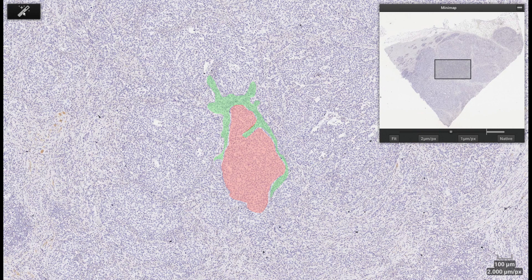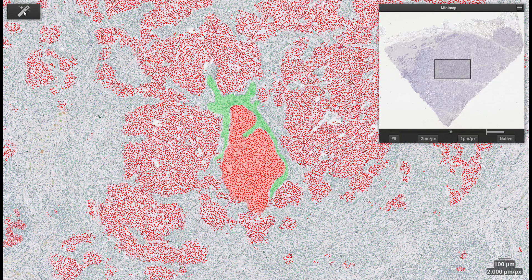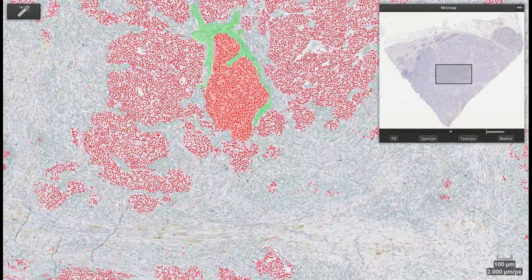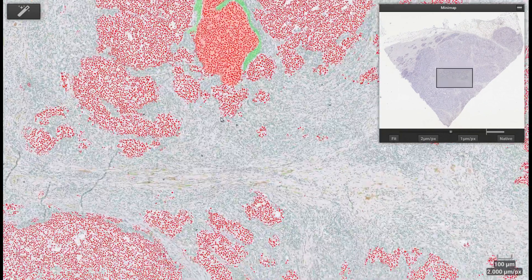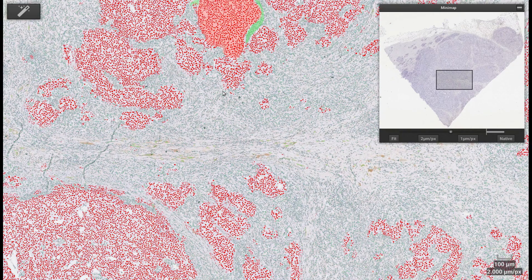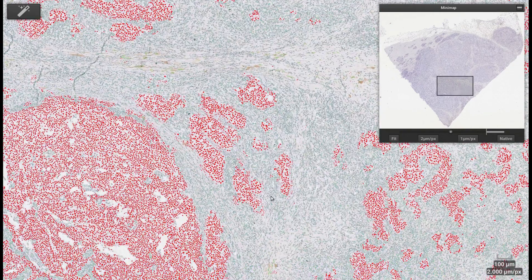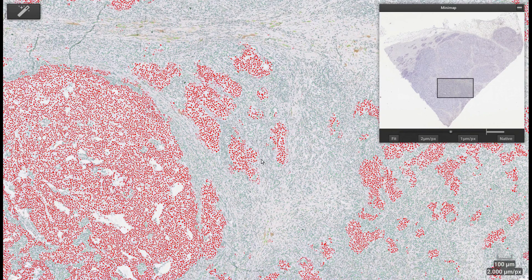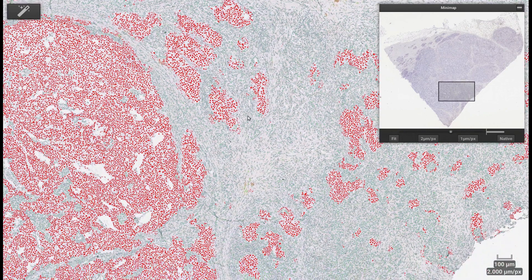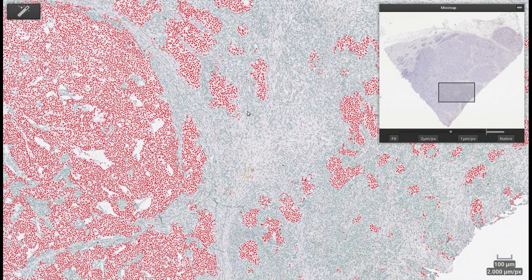The system provides the results quickly, in the order of seconds. The system displays all detected cells — typically between 500,000 and 1,000,000 for a whole slide — with different colors for the different tissue types. Here we display tumor cells in red and stroma cells in green.